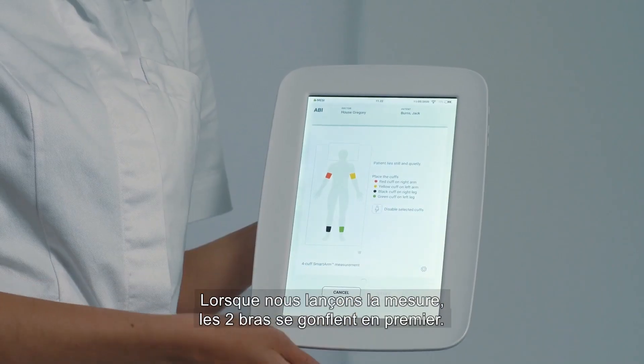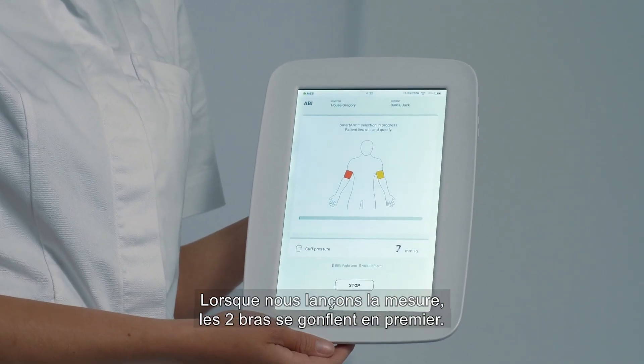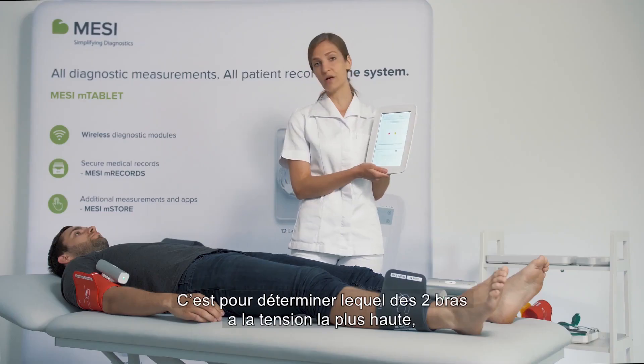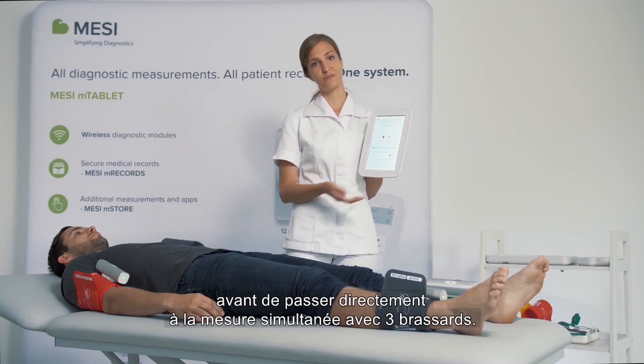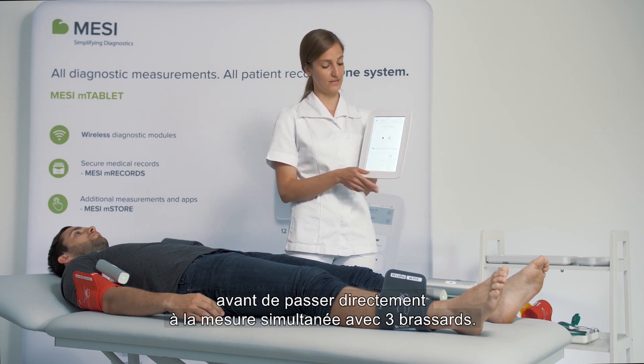When we press the start button, the arm cuffs start inflating first. This is to determine the higher of the two arm blood pressures before the measurement jumps straight into a three-cuff simultaneous measurement.